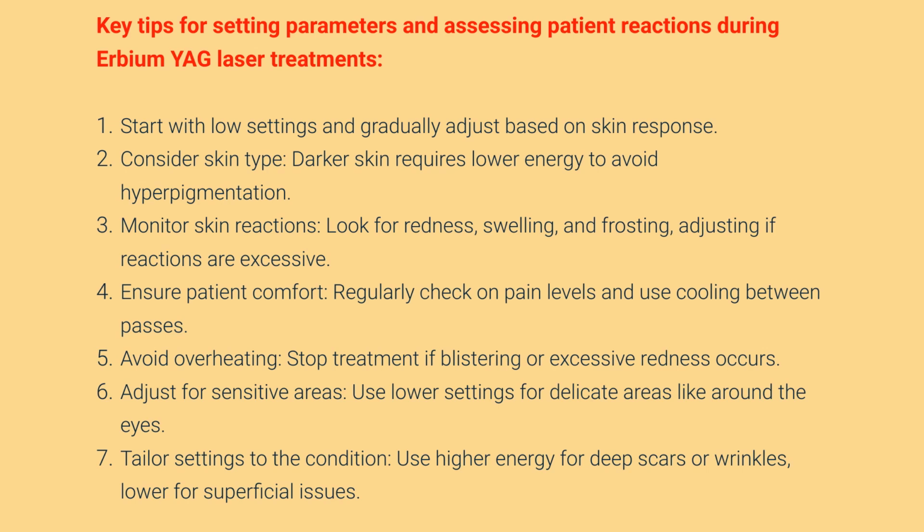5. Avoid overheating. Stop treatment if blistering or excessive redness occurs. 6. Adjust for sensitive areas. Use lower settings for delicate areas like around the eyes. 7. Use higher energy for deep scars or wrinkles, lower for superficial issues.